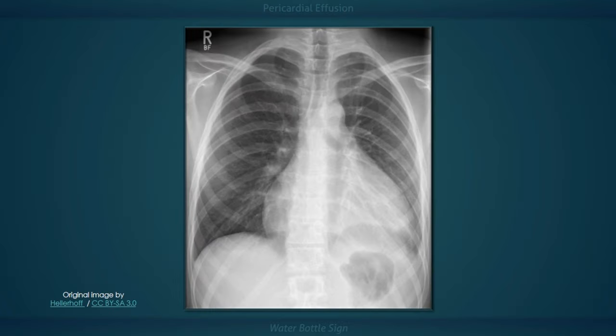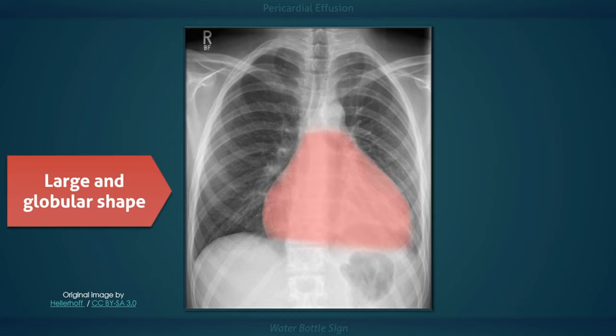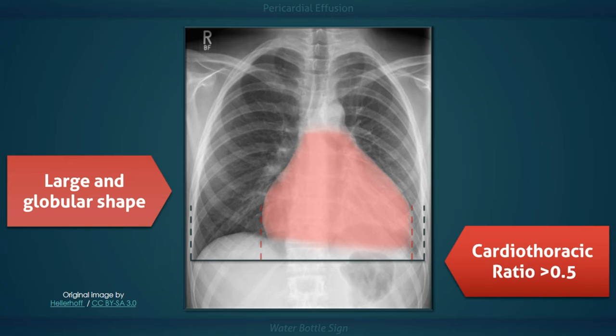When looking at this chest x-ray, the first thing that may come to your attention is the unusual appearance of the cardiac silhouette. It has a large and globular shape, which apparently resembles an old-fashioned leather water bottle — a fitting description since the pericardial sac is filled with fluid. More objectively, the cardiothoracic ratio in this image is approximately 0.6, which is larger than normal. On a posterior-anterior radiograph such as this one, the cardiothoracic ratio should be less than 0.5.